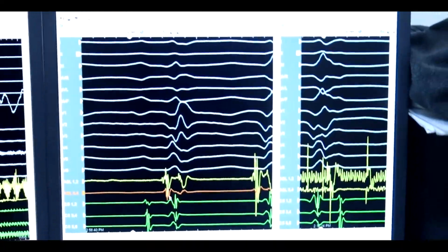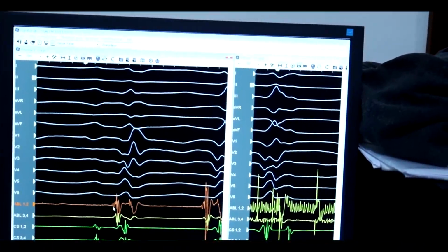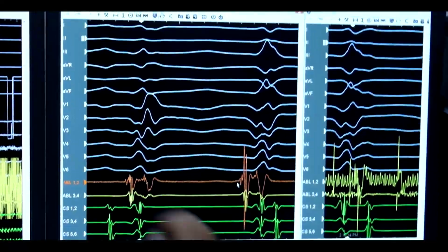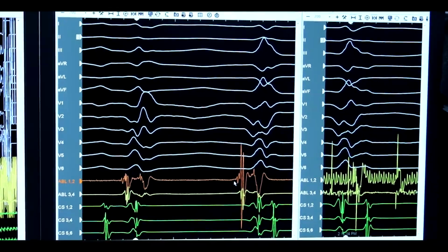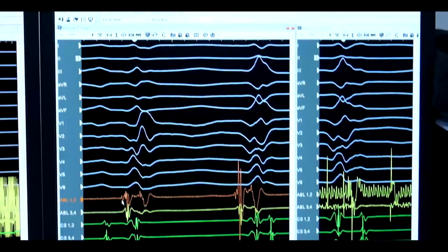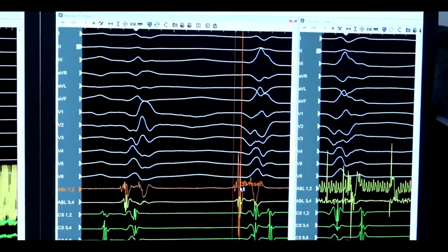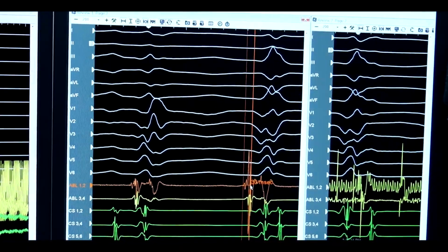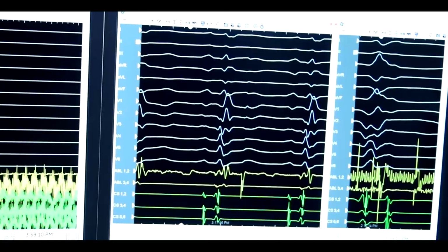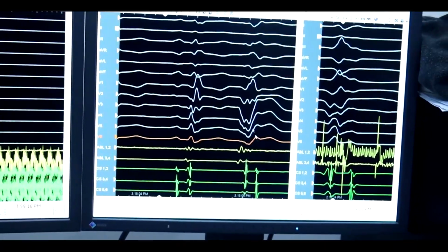First of all, at the site of ablation, you can see clearly that there is a small potential preceding in sinus rhythm. Also, this is the same potential. This is the site where we ablated at first and eliminated the PVCs and VT. The potential is during sinus and even during PVCs, and it precedes the QRS complex by about 30 milliseconds. Look after it's gone. It's gone. As you can see, you try to eliminate all the late potentials. How about this beat?